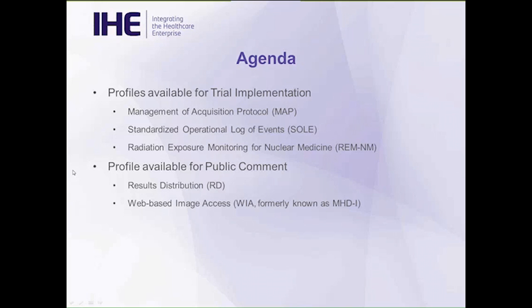IHE Radiology is also going to present some major upcoming changes to existing profiles, which includes the results distribution, a new supplement published in 2017, which deals with sending results, reports, etc., to existing installed base systems. The results are defined with structured content and support other integrated profile requirements such as follow-up of non-critical actionable findings.